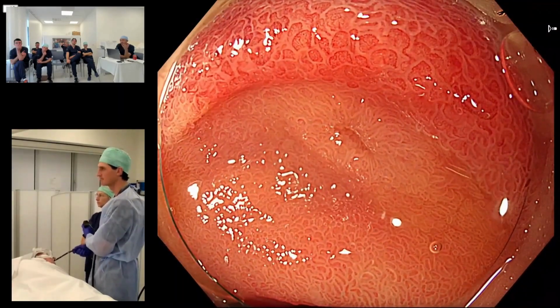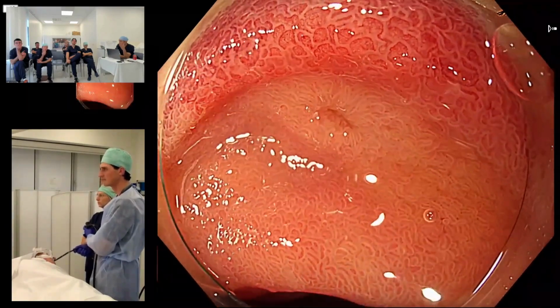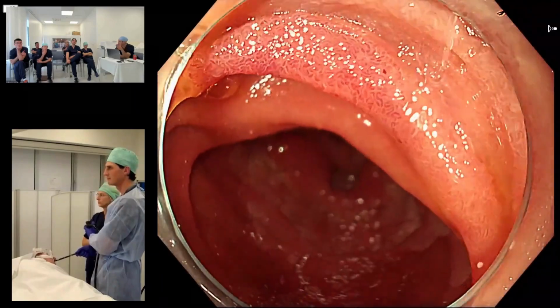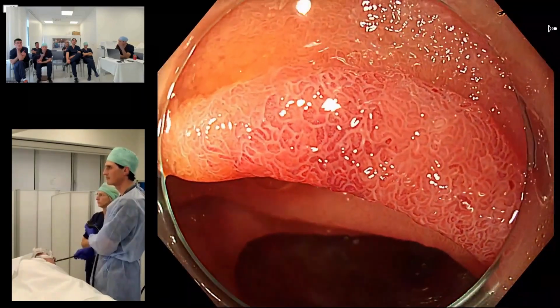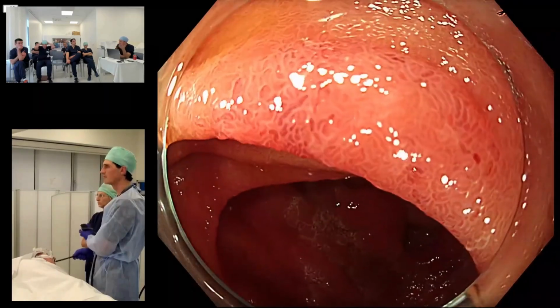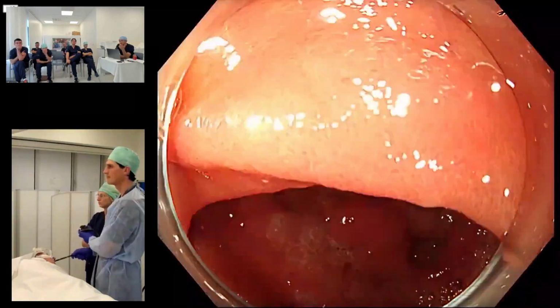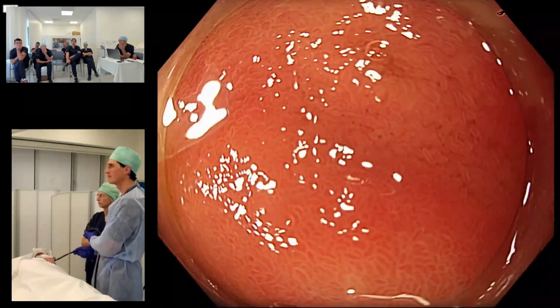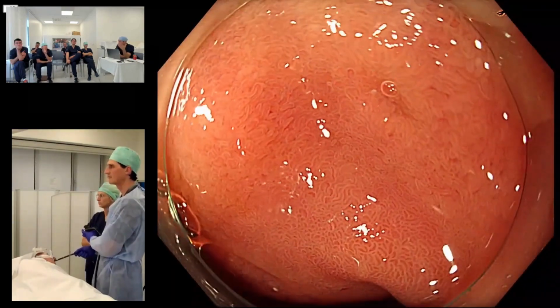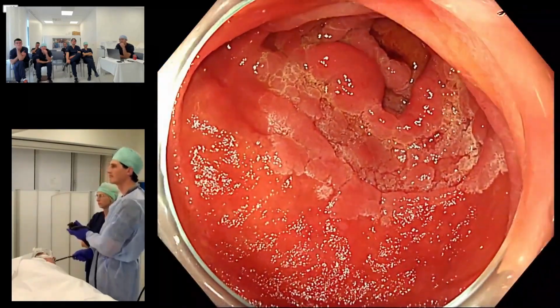Very nice. So if you have an undetected divisum, as in you don't look for it, you resect a polyp which involves the minor papilla, and the minor papilla is the major drainage of the pancreas, you get a pancreatitis unless you have put a stent in. So this is the reason for looking for it. And how do you figure out if you've got divisum or not? We have to do MRI or EUS up front. So that's very important, and it's often not done in these cases.